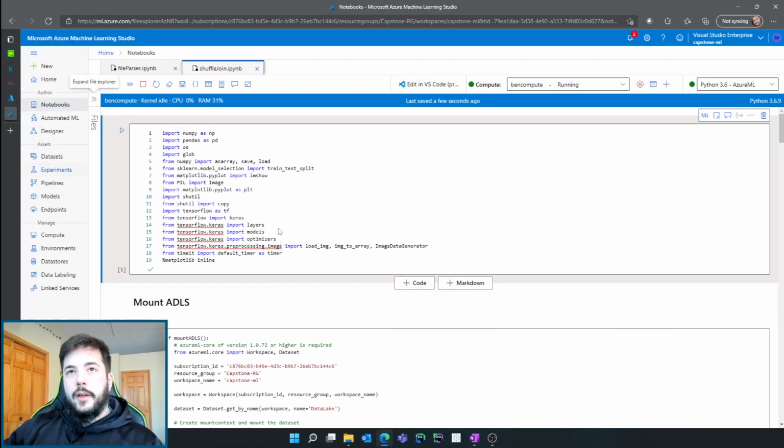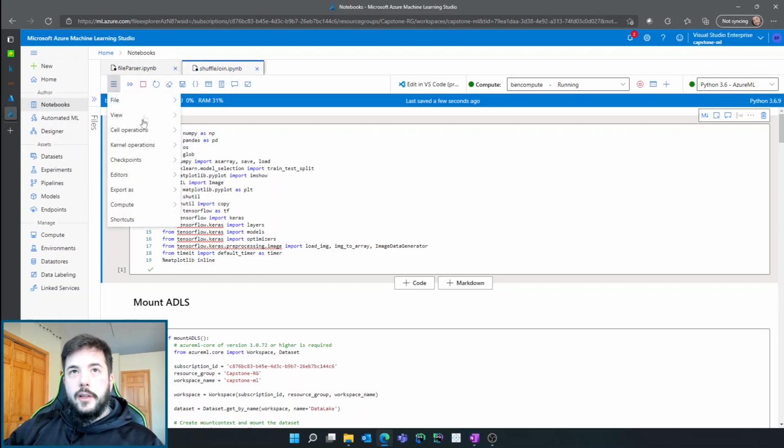Okay. Anyways, here's another file. I'm going to hit table of contents real quick.